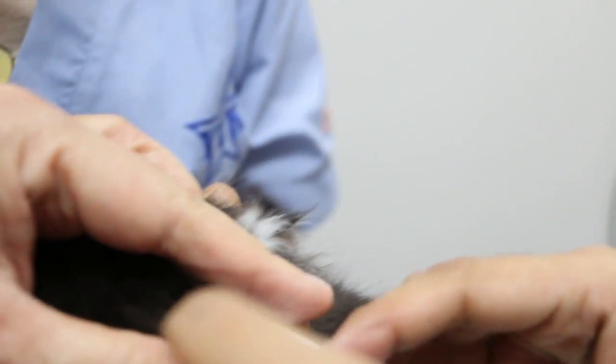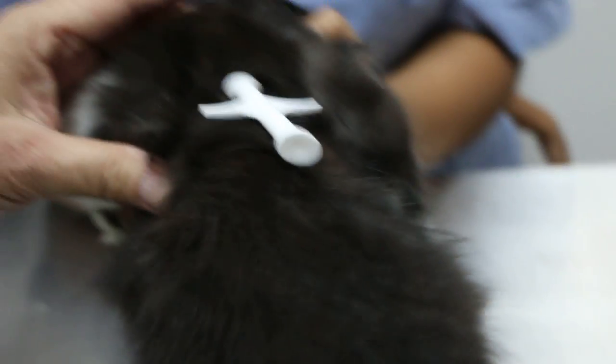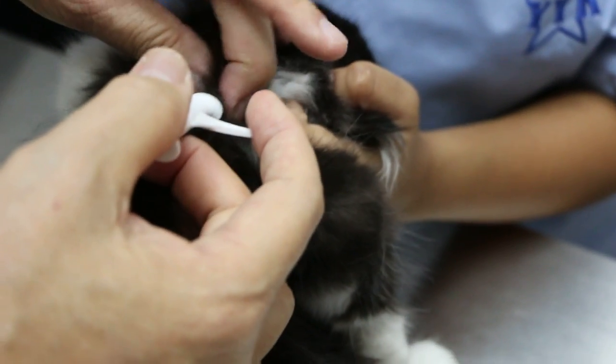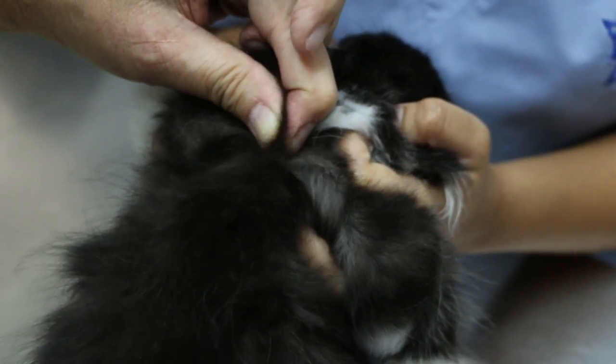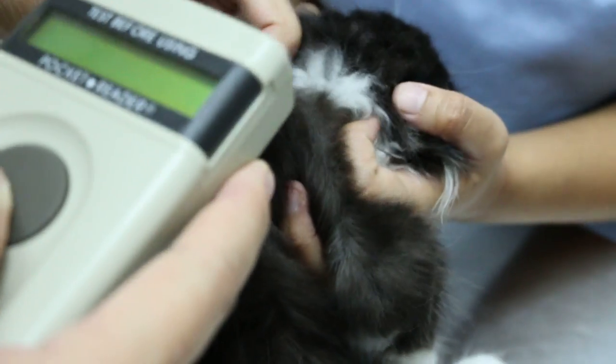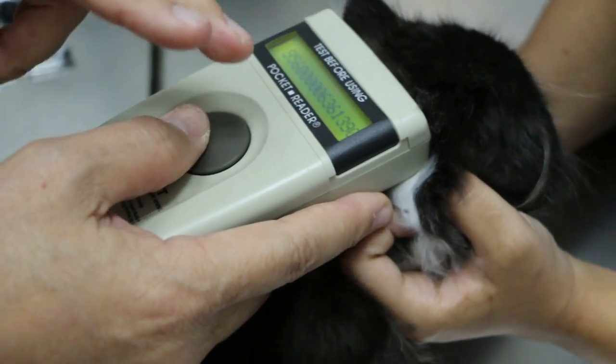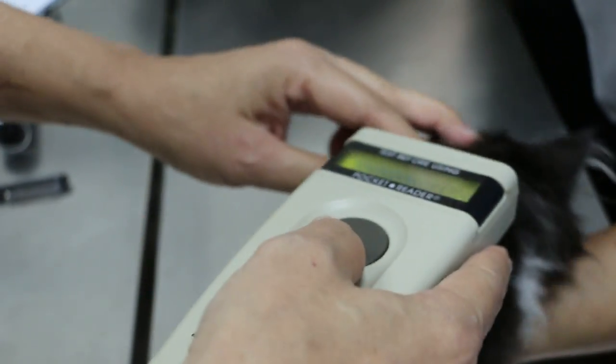You take out first. No, this is a new one. Okay, take out that one first. Okay, wait, pull out the skin first. Okay, you hold first. Okay, in already. Then just make sure it doesn't come out. Okay, let's examine it. Scan. Okay, it's here. The microchip is inside. So check again, see whether it doesn't come out.